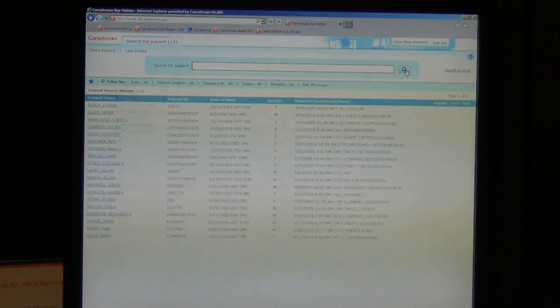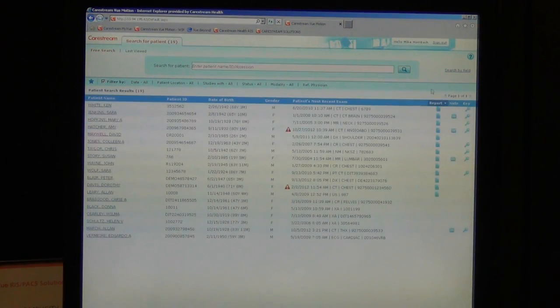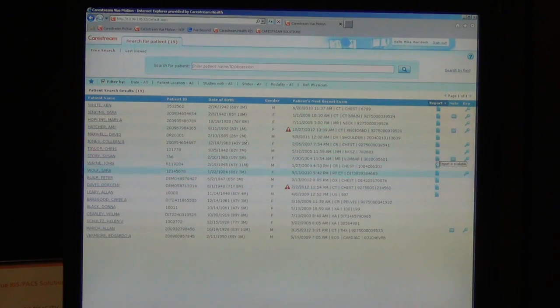When I log in, I can search for a specific patient by name, ID, or accession. I can filter by any number of criteria including date, patient location, status, modality, etc. Or in this case, I'm just going to sort by patients that already have a report.